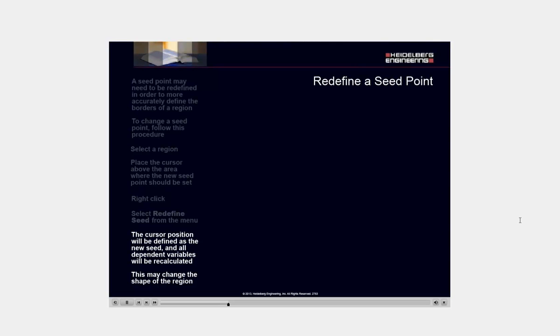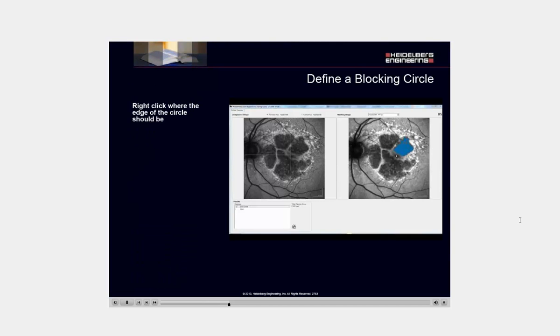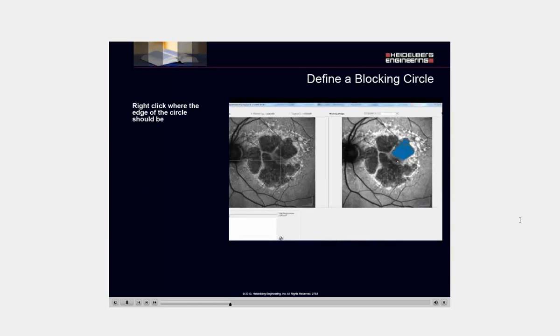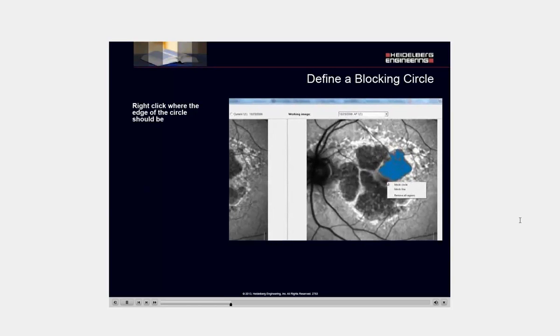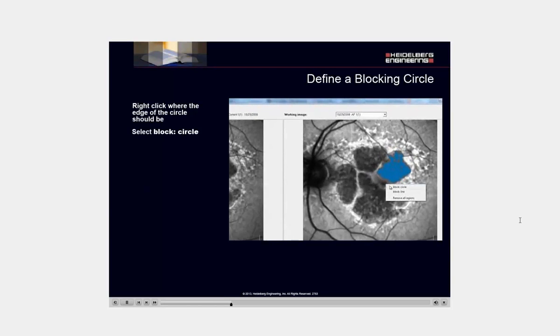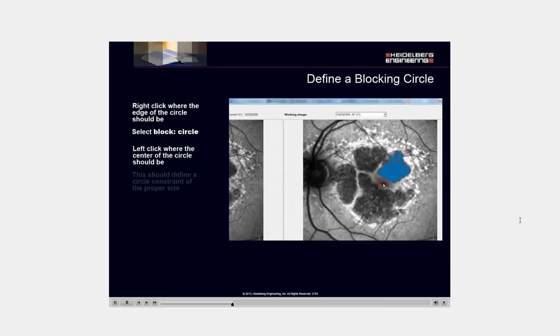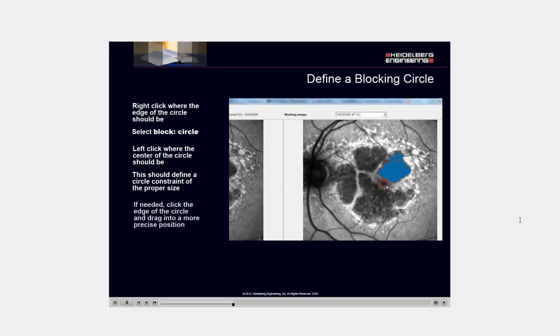Right-click where the edge of the circle should be. Select Block Circle. Left-click where the center of the circle should be. This should define a circle constraint of the proper size. If needed, click the edge of the circle and drag into a more precise position.